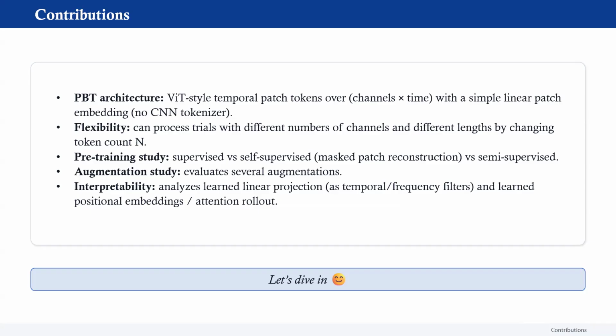In tasks where frequency plays a key role, for example sleep staging, we know very specifically that for a particular stage of sleep, certain frequencies will be dominating. So in such applications, using spectrograms has been shown to be very effective. So that is one method of doing it.